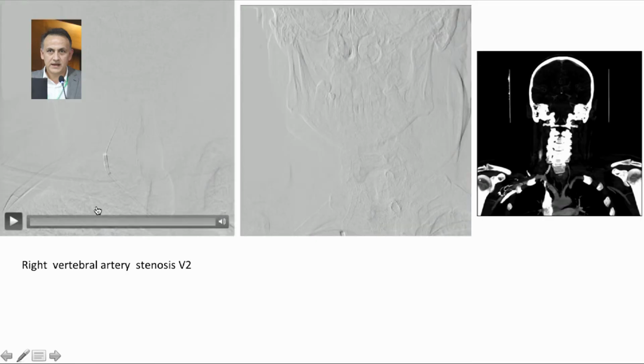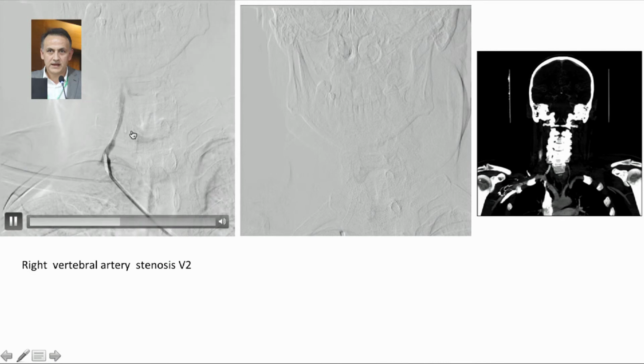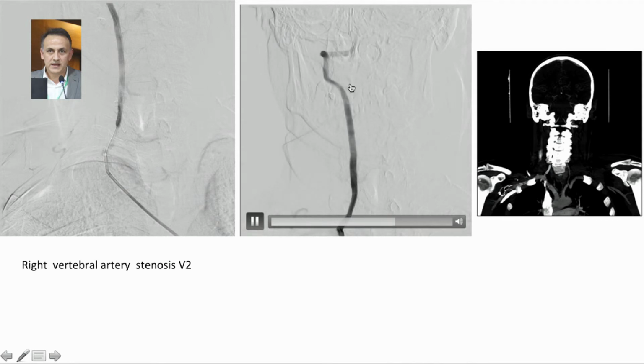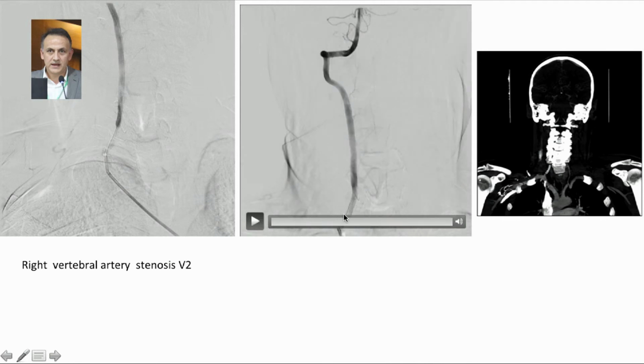And in this patient, we had vertebral artery stenosis. You see, and we treated this not at the same session, but after 2 weeks.